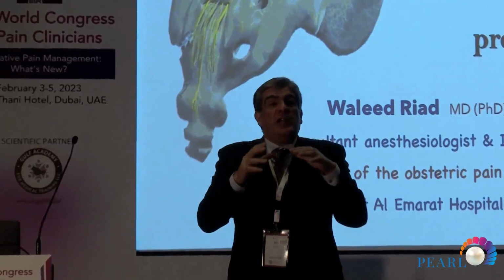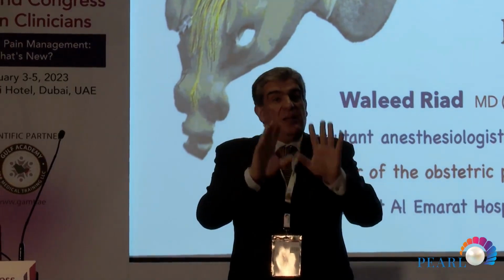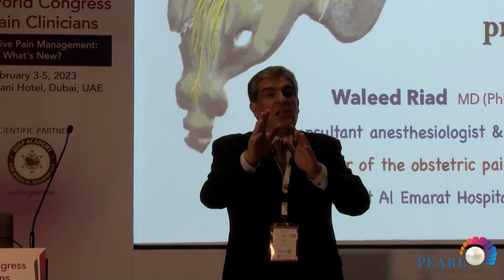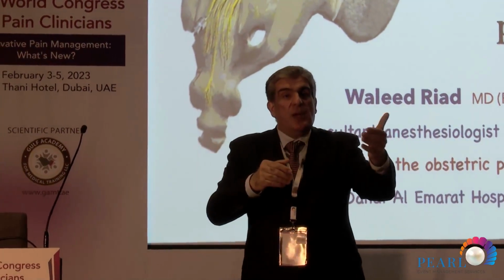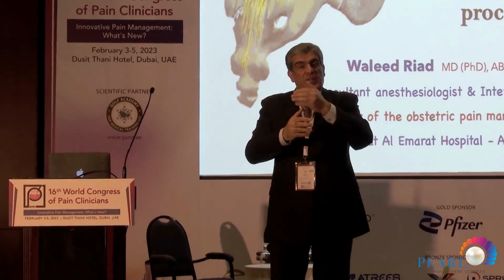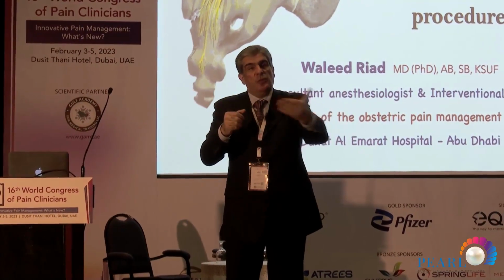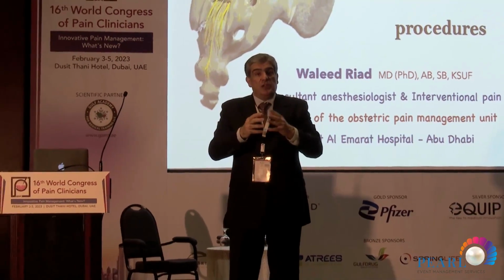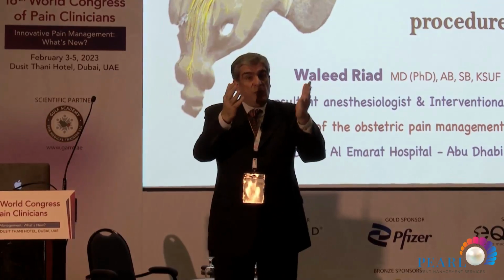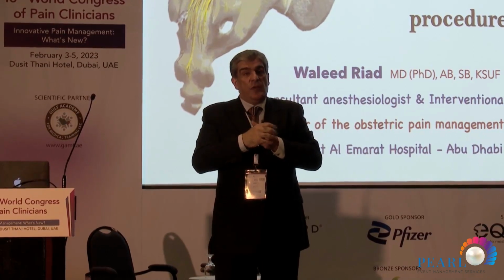Definitely with hardware, we're worried about the visualization of the foramen. We didn't do it yet, but I think it's going to be difficult to visualize the foramen under the rods. So maybe I would stick to fluoroscopy with a paramedian approach, doing a sleeve approach from the paramedian with hardware, to be as far as possible underneath the hardware, not touching the hardware for infection problems, and to be able to reach the foramen. I don't do it under ultrasound yet, but we need to explore it, but I think it's going to be difficult to reach the foramen whenever you have rods.